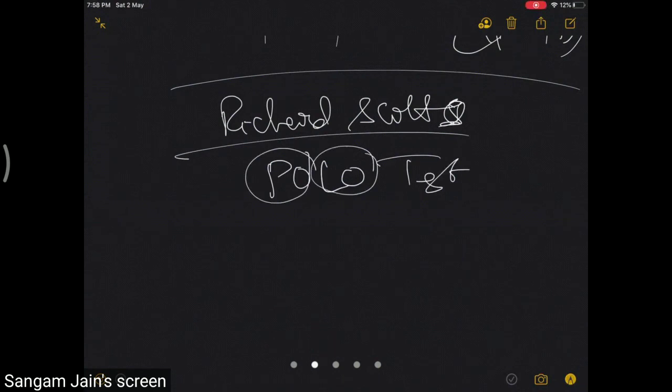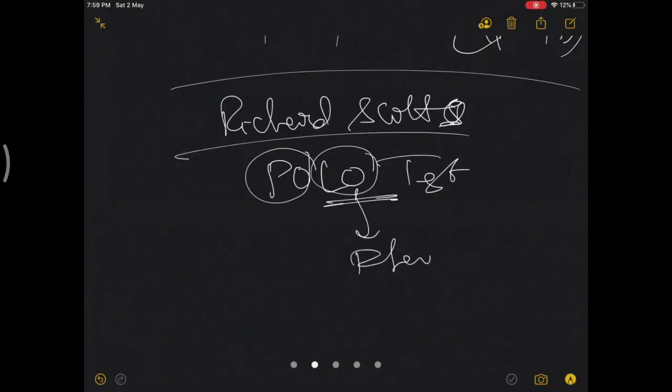When you do trialing, if you observe a lift off of the tibial base plate along with the trial insert on flexion, that tells there is a flexion tightness.